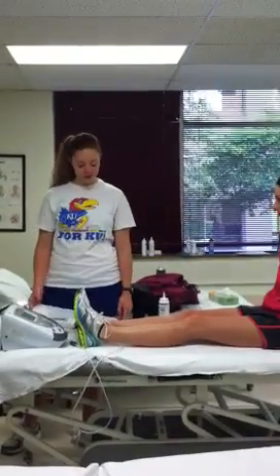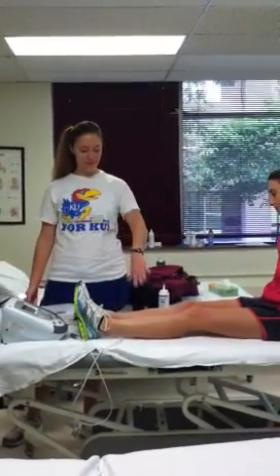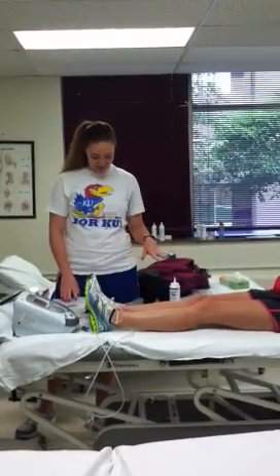We have ultrasound for wound healing. As you can see, Brianna's our patient, but she doesn't actually have a wound, so we're going to pretend she had like an ulcer on her leg.